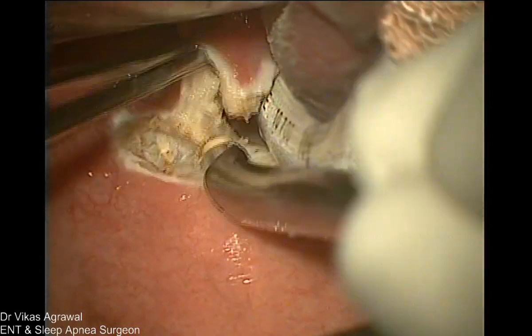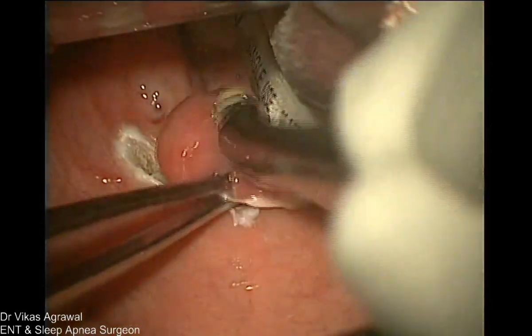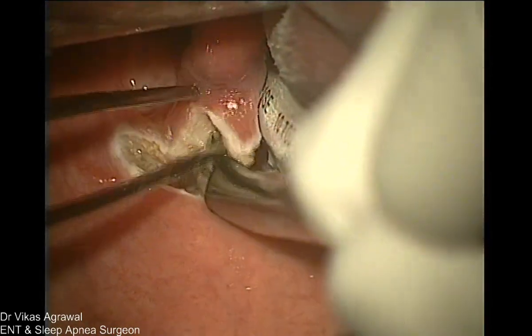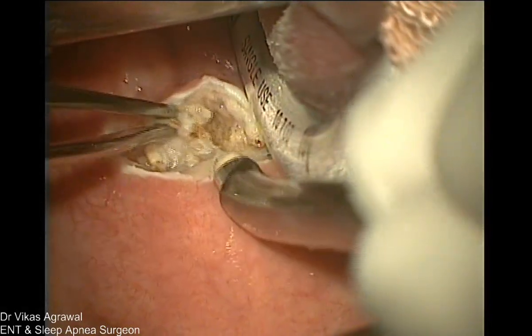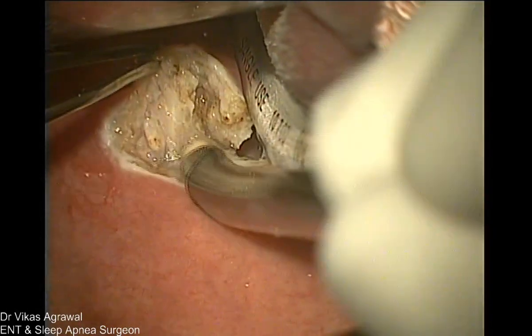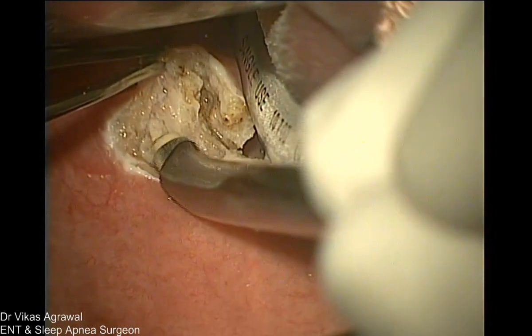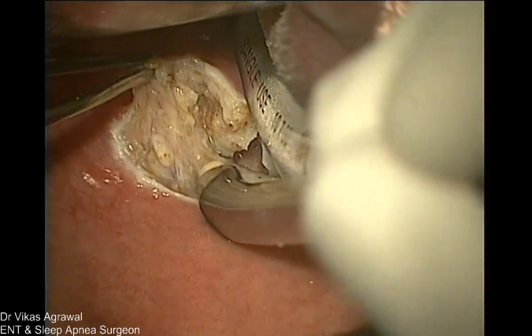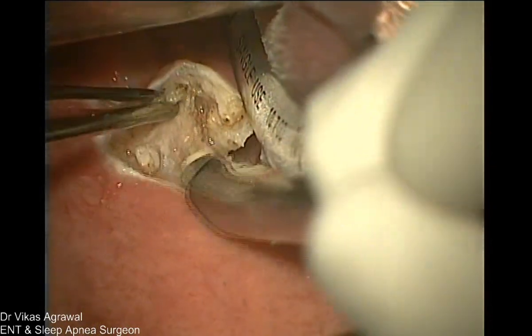And this is the posterior pillar. I'll just make it very, very clear to you. Can you see this is the posterior pillar? Let me remove this and you can see the direction of the fibers very clearly. Okay, can you see the fibers now very well? Yeah, seen very well. This is the pad of fat. So I am into the supratonsillar pad of fat and these are the palatopharyngeal fibers.